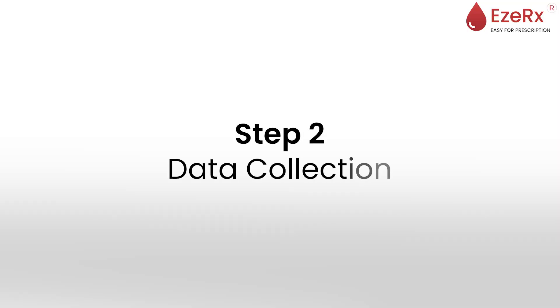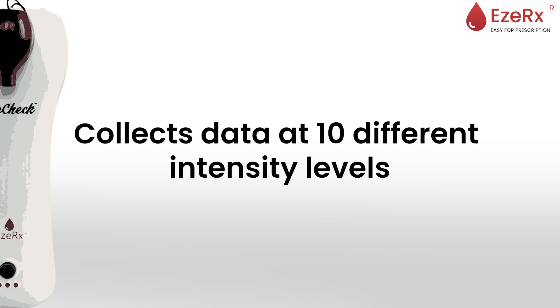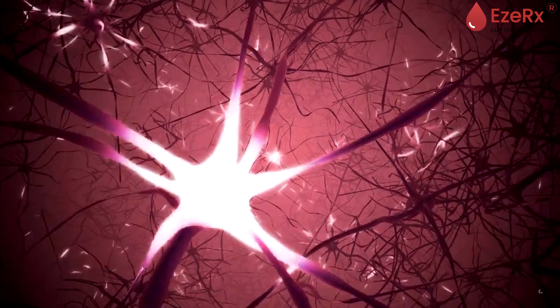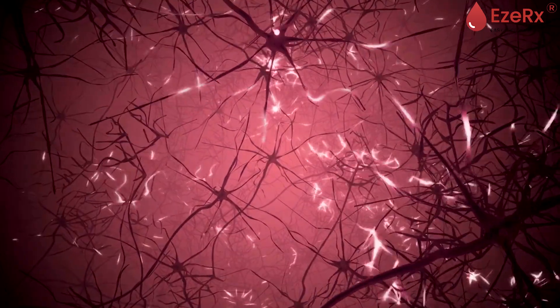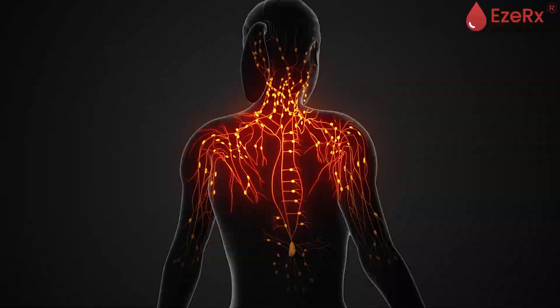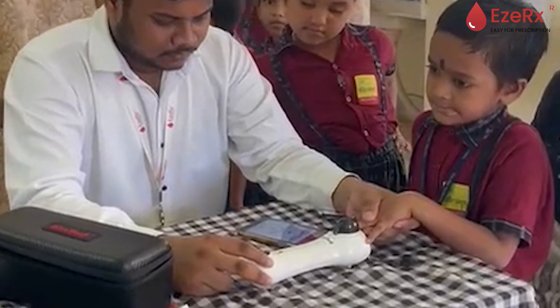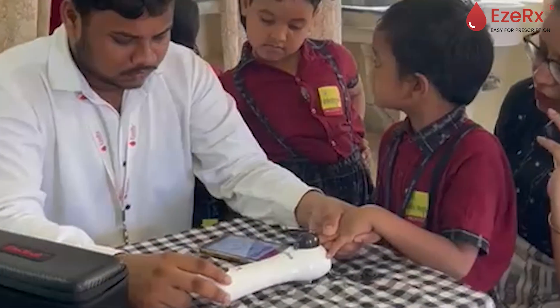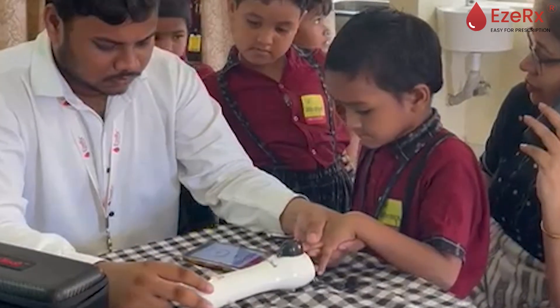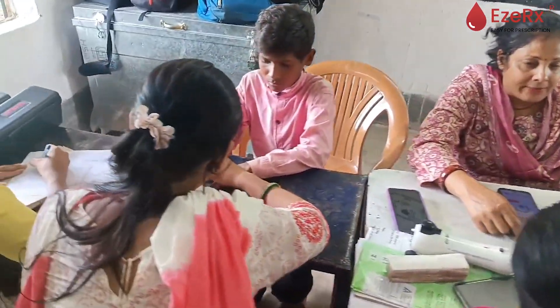Step 2: Data Collection. EasyCheck collects data at 10 different LED intensity levels. These multi-level signals penetrate the tissue and capture precise readings of the hemoglobin levels inside your body. This high level of precision is what sets EasyCheck apart, ensuring accurate results with every use. The process is not only fast, but completely painless, offering a hassle-free experience for the user.